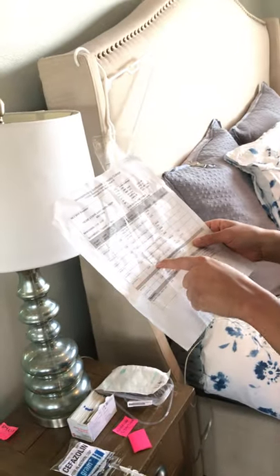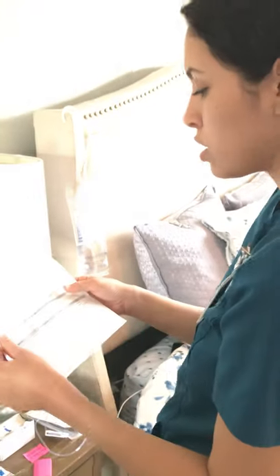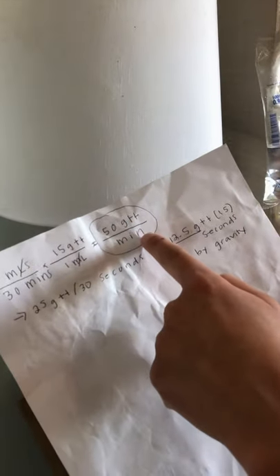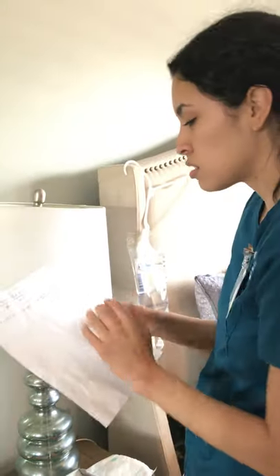I note that she has normal saline running, and I have checked that it is compatible with her Cefazolin. I'm going to show my math here: 50 gtt per minute by gravity is about 12.5 gtt per 15 seconds, so approximately 13 drops per 15 seconds.